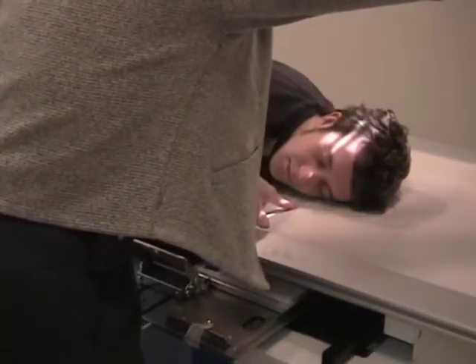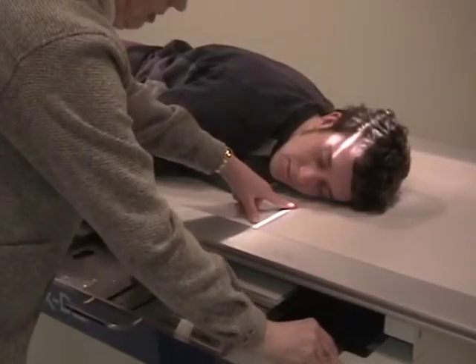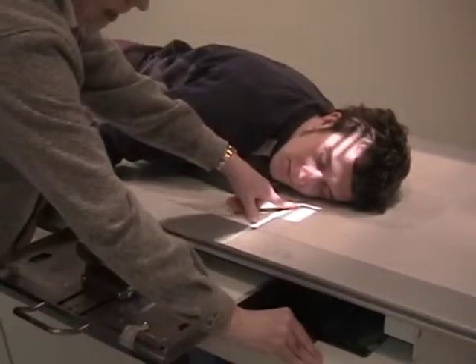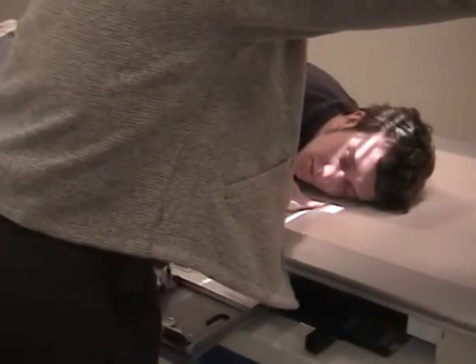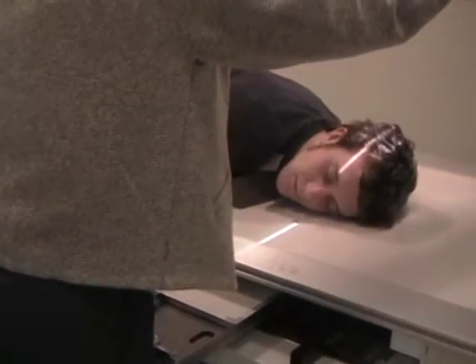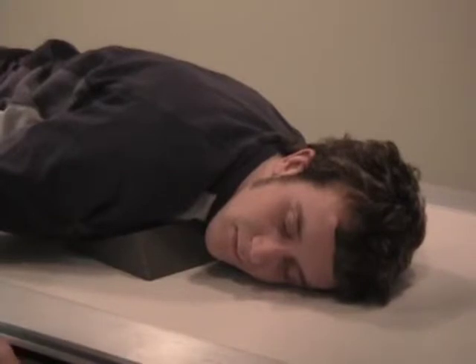The Bucky tray did not move far enough up, so I had to realign everything. And then I have it exiting to the center of the film. And we'll take the tube back, make sure it's transversely centered. Very tight collimation on the lateral, both vertically and side to side. And I can elect to change the plane of the film because it is so tight I can actually go lengthwise if I wanted to.